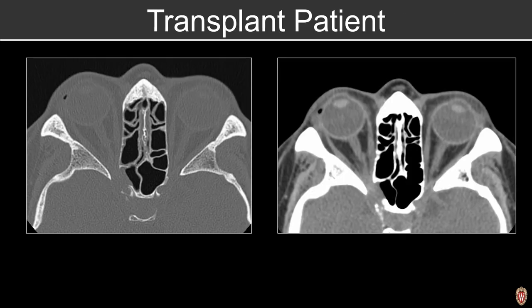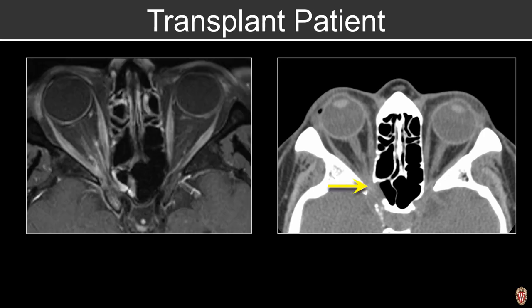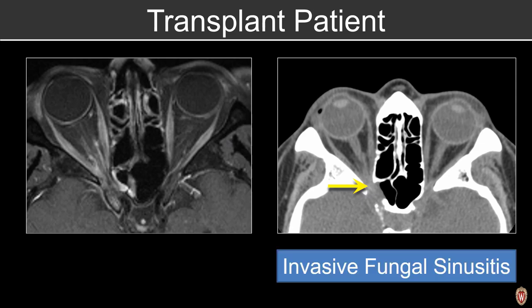In this transplant patient, we have to have a high index of suspicion for pathology. On bone windows we can see mild mucosal thickening within the ethmoid air cells and a focal area of dehiscence along the posterolateral margin of the sphenoid sinus. On soft tissue windows, there is focal opacification at the level of the orbital apex. In this transplant patient we have to be worried about invasive fungal sinusitis, and on MR we can see abnormal enhancement within the orbital apex — this patient had confirmed invasive fungal sinusitis.